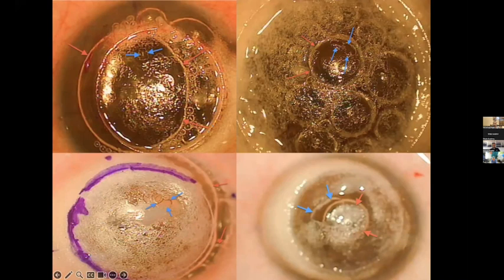So remember that if you find a bubble like this in this side, this bubble probably is a small type 2 bubble, and you should avoid, because this is usually in a very wide plane, which is between the predescemetic layer and Descemet membrane.